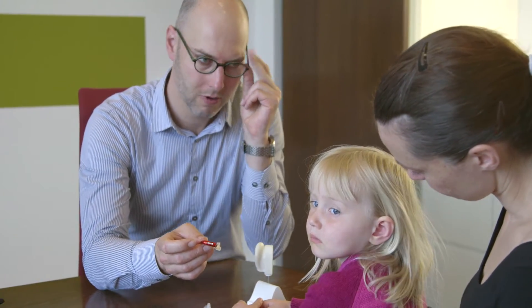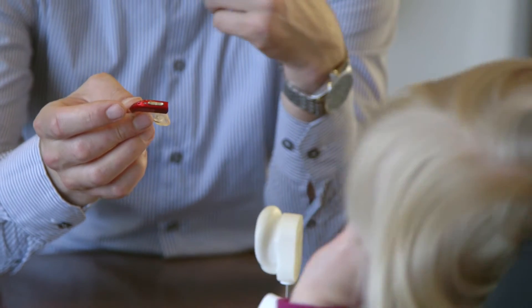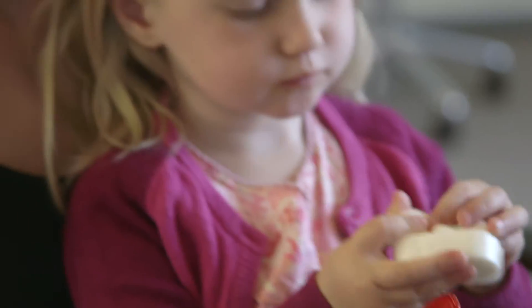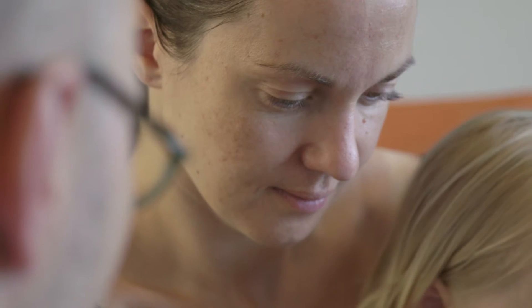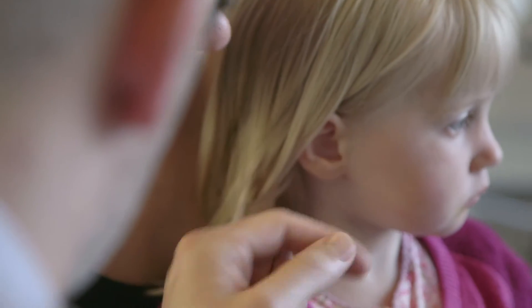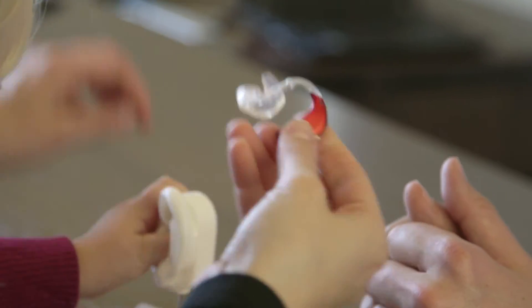Parents have a huge responsibility in their child's hearing care, since young children cannot report if something is wrong with their hearing instruments. Correctly inserting an ear mould into a child's ear can be a challenge. Correct ear mould placement ensures the hearing impaired child receives the sounds they need and also secures the hearing instruments in place.